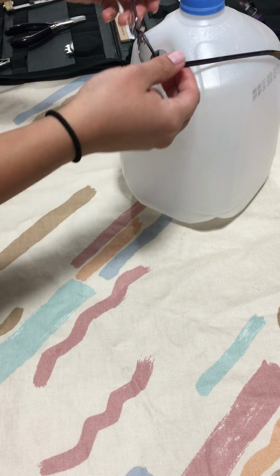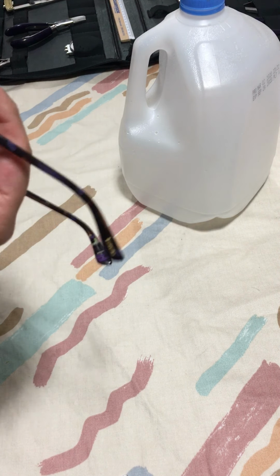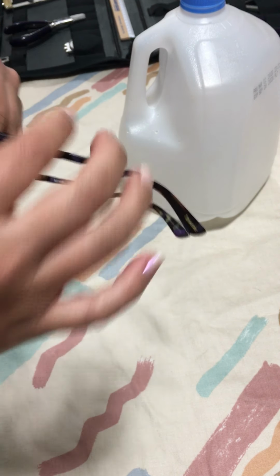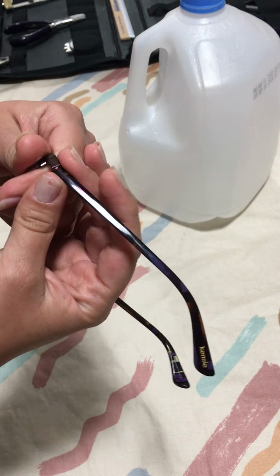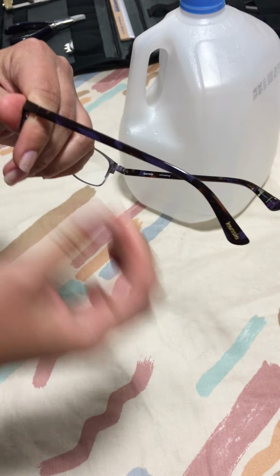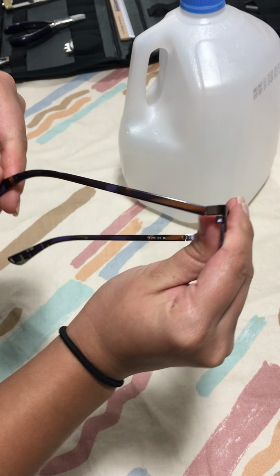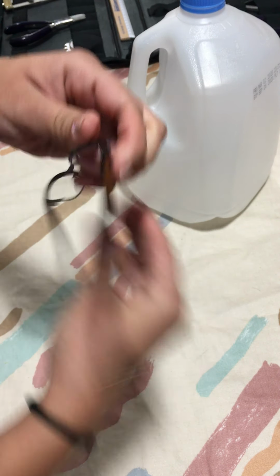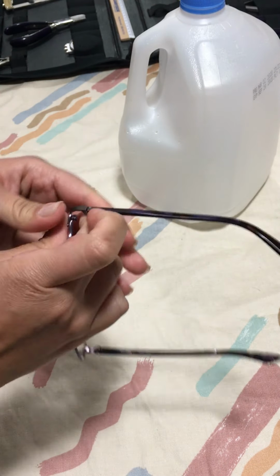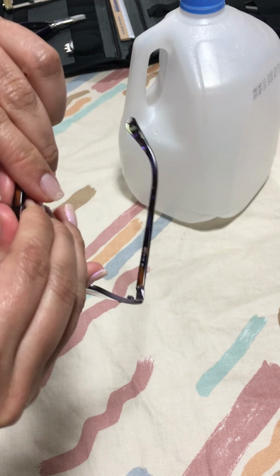So in order to remove that, again, I could use my wide angling plier, but in this case, I will use my finger because the frame front and the end piece are a little bit too hard. So what I'm gonna do is I'm gonna just bring it down right here. Now it looks a lot nicer. This is one side. This is the other side right here. See? So I'm gonna do the same thing. Okay. Now they're both looking a little bit better.